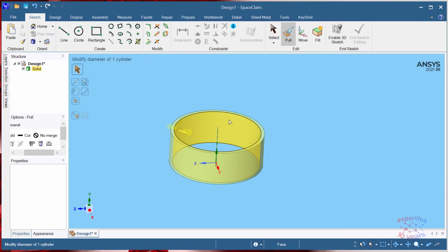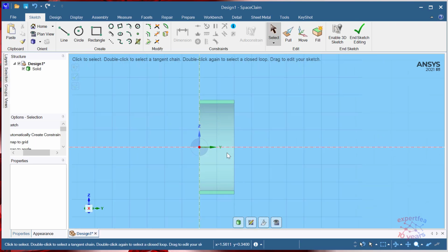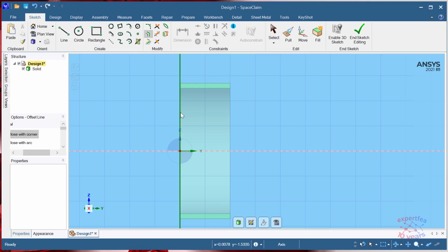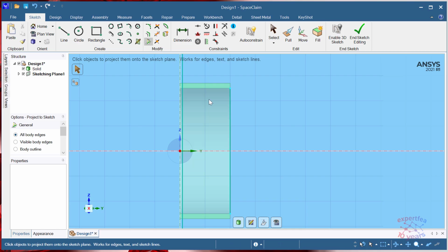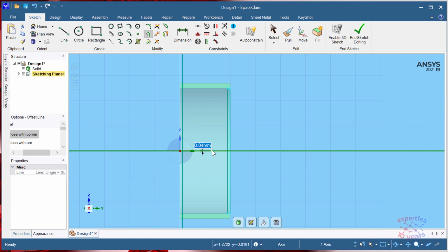So let's create some windows inside this cylinder. I will click this axis, then go to Design Sketch Mode. I will click the plan view, and let's make a window here. I will offset on this edge, this axis, with 0.1. I cannot select this edge, so let's project it to our sketch, project to sketch. Let's offset it with 0.1. Yeah, I said that the window will be of 2 mm. This means 1 mm offset here, 1 mm offset here.